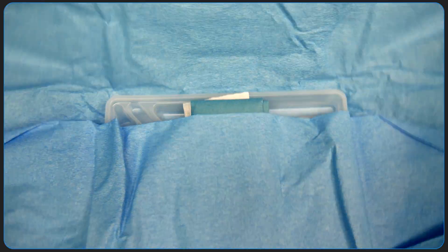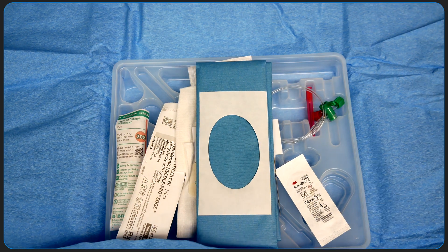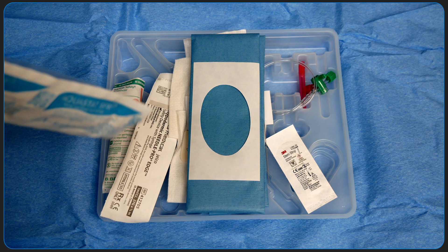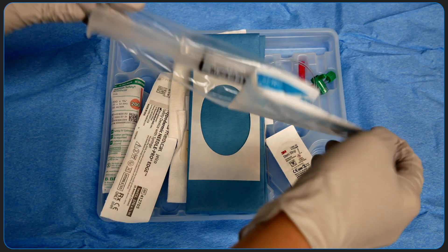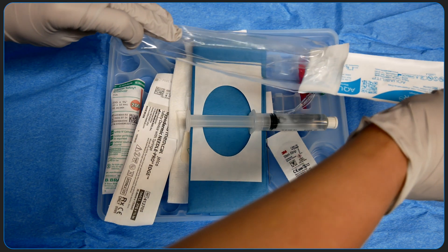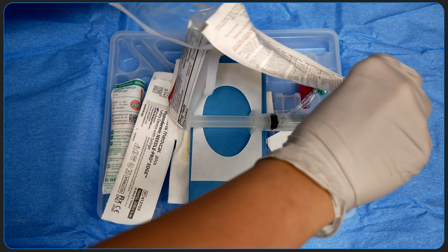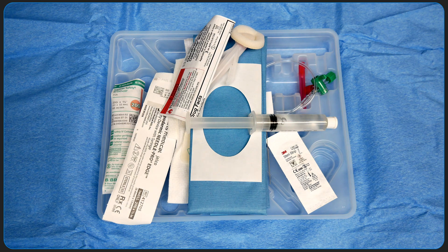Everything within the open kit is sterile, which means I'm going to need to don sterile gloves and use sterile technique when handling these supplies. The only item that actually needs to be added to this kit is a sterile saline flush. You can either open the chloroprep onto the sterile field or just clean the patient's skin before you actually don your sterile gloves.